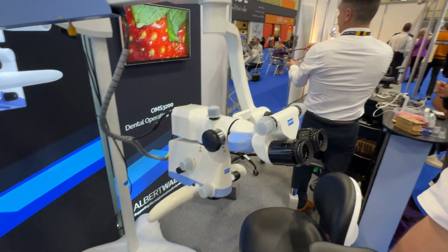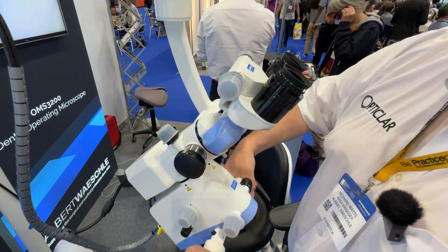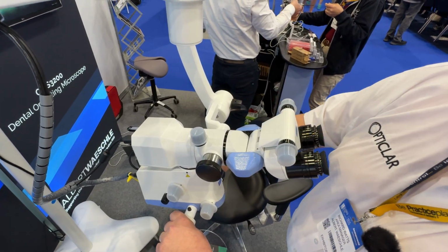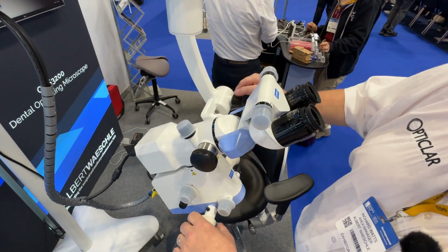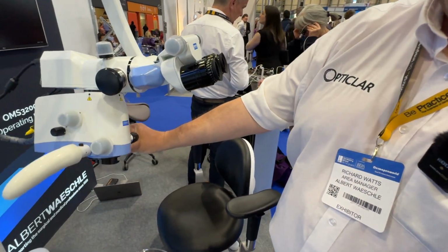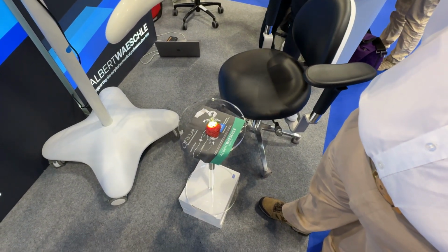I love this. I also noticed this. What does that affect? This joint movement here. Ah, right, okay. I've loosened that off, so it's a friction screw. So that's really soft movement now, but it will fall back. I've loosened it too much. Turning to the right, if I turn it all the way to the right, it won't move at all. It's fixed solid in position. So all you do is loosen it off and move it so that it'll stay in position without falling back while still moving nicely. You should be able to move these with one hand, and the moment you let go, it fixes in precision. And when you've got that small light, you're going to see what that light's pointed at.